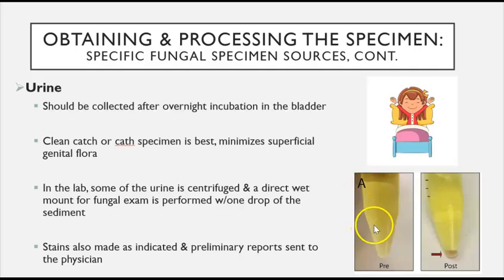If you look over here to the right, of course, this would be your urine sample before the sample has been centrifuged. This would be after the sample has been centrifuged, because you have your pellet of sediment down here at the bottom of the tube.